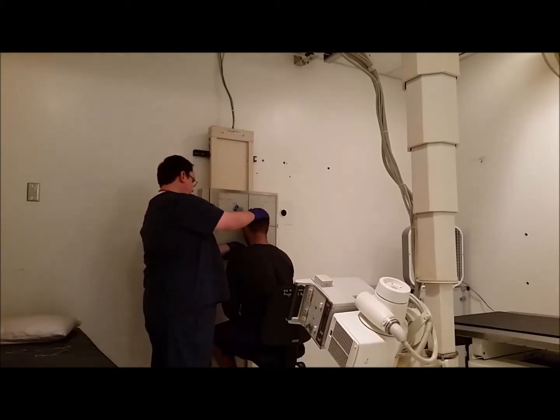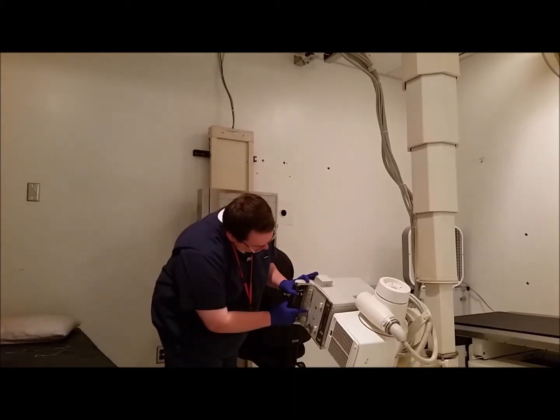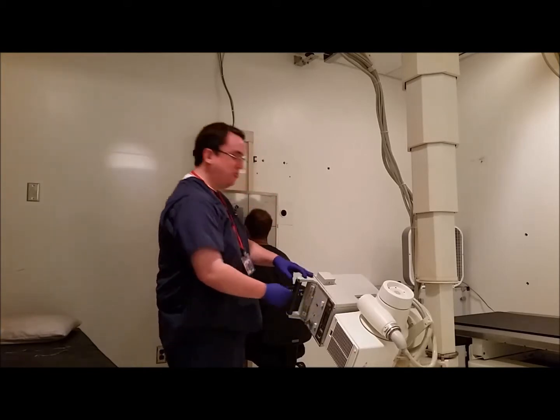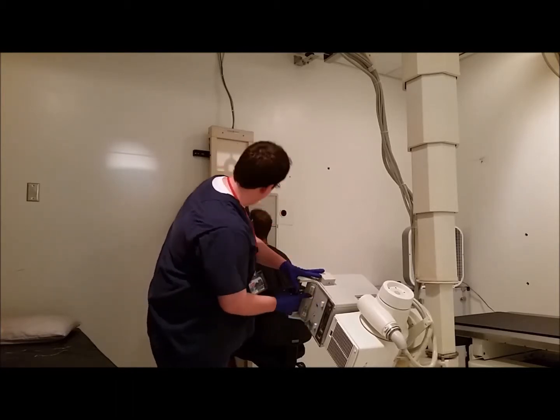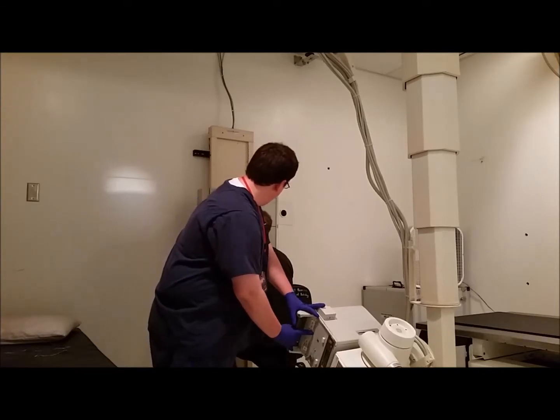Next, I'm going to have you raise up your chin, so your chin and your nose touch right there. Going to increase our angle a bit to about 30 degrees. Up. For this one, we'll be visualizing the body of the mandible. This time, have our CR exit right about the lips there.